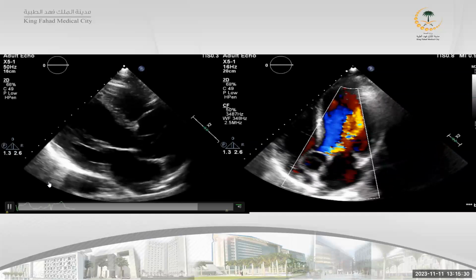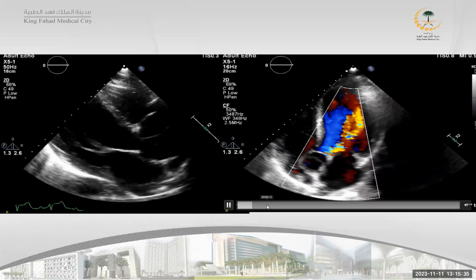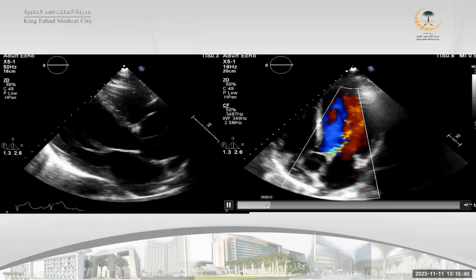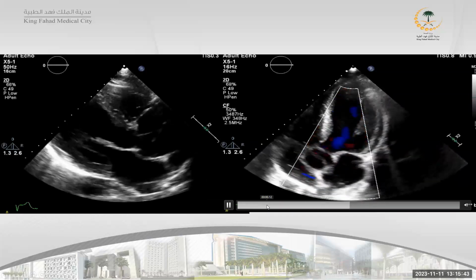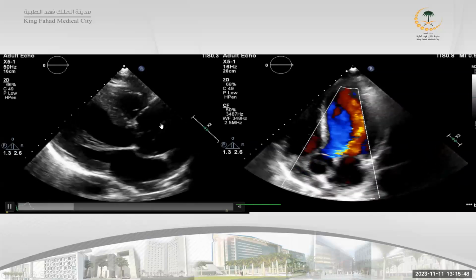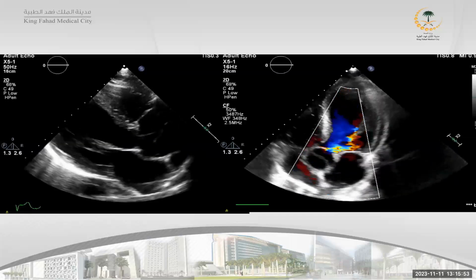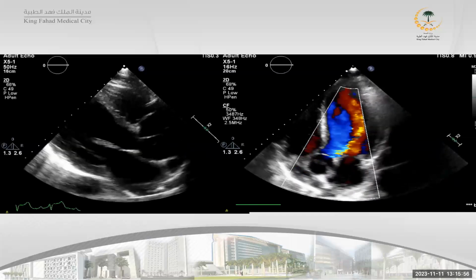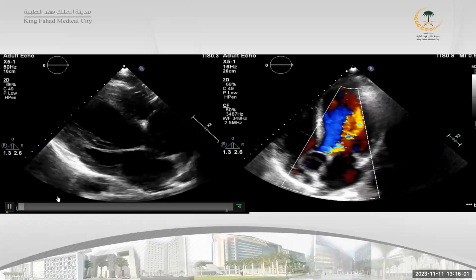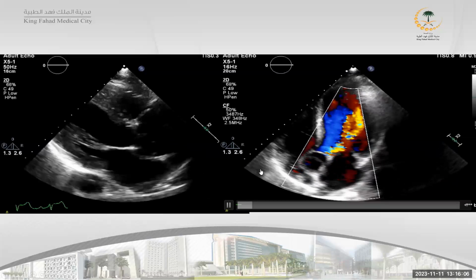Also it's important to know not only the finding, but any complication of this finding in this echo. What I know usually in the exam, especially of FF3, they ask you to code 4 answers. However, sometimes you may know just 2 or 3, but you can write at the end that, for example, you have normal LV size or normal LV function, normal ejection fraction, especially if it is related to the finding, and also normal RV.